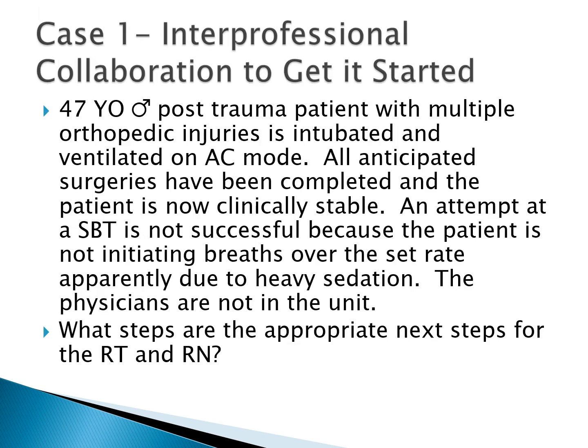Now let's take a look at a few cases. The first case is really about interprofessional collaboration. A 47-year-old male, post-trauma patient with multiple orthopedic injuries, is intubated and ventilated on assist control mode. All anticipated surgeries have been completed. The patient is now clinically stable. An attempt at a spontaneous breathing trial is not successful because the patient is not initiating breaths over the set rate, apparently due to heavy sedation. The physicians are not in the unit. What are the appropriate next steps for the RT and the RN to take?